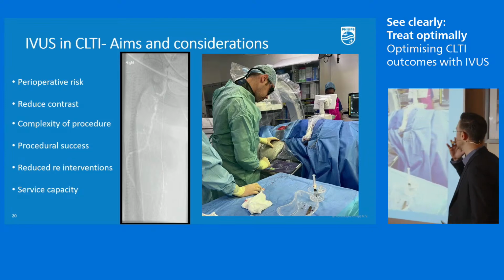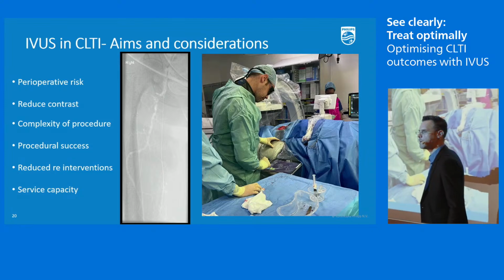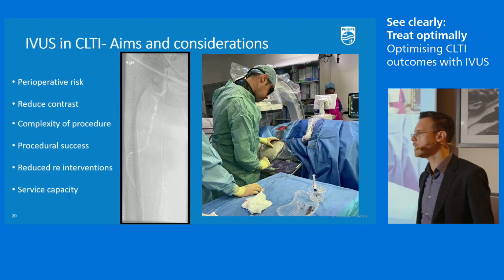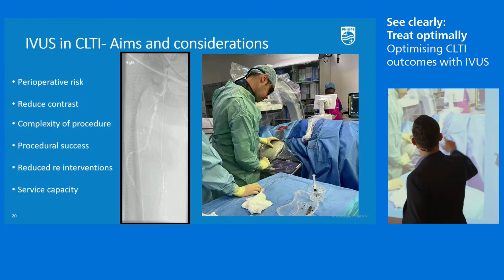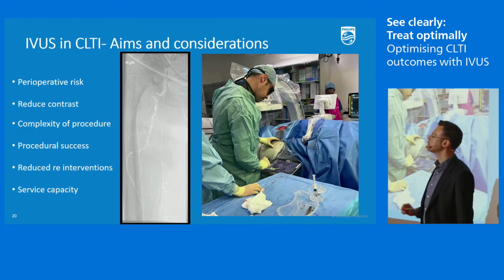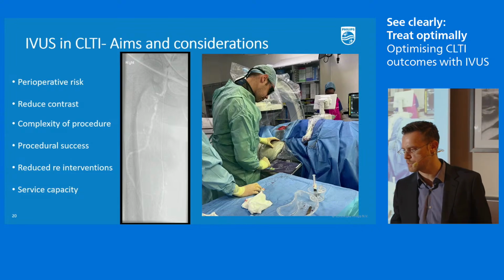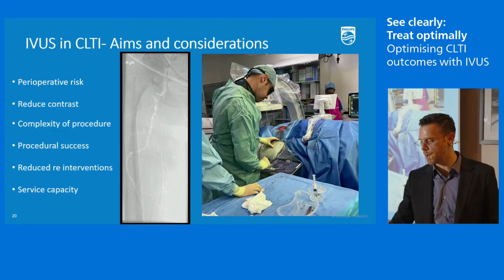And you can see from this photo, I'm very, very pleased with my new TSM touchpad, by the way. Very happy with my ability to drive the IVUS under the sterile drape there. But you can see we've got a mobile C-arm. You can see I'm cramped for space despite this being a hybrid facility. So everything we do is really compromised.